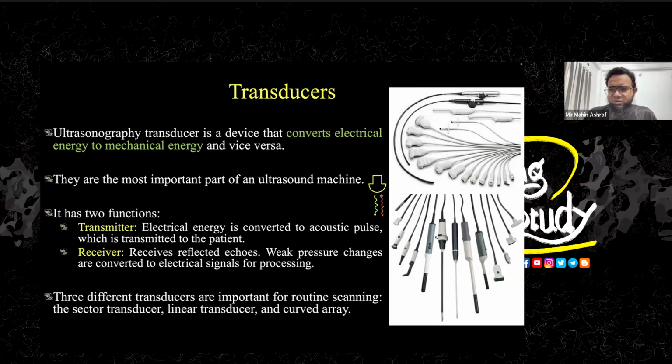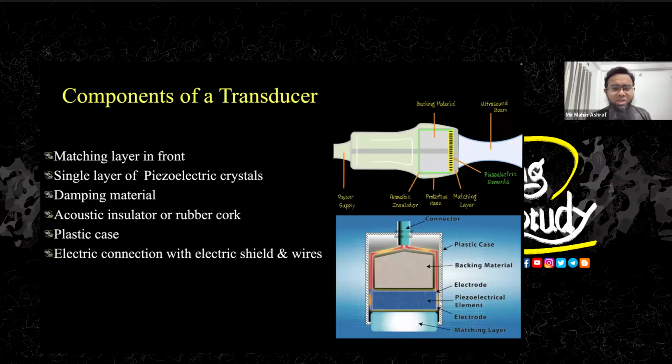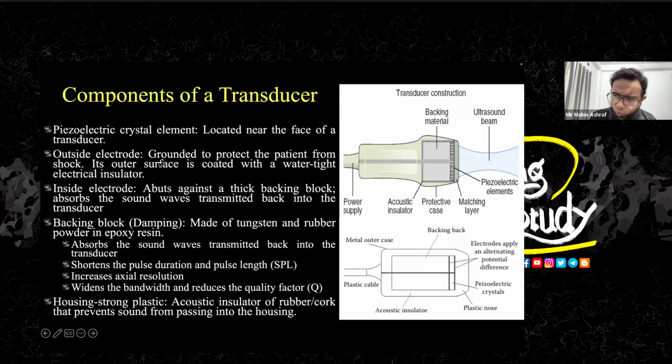If you don't have a transducer, what will you do? You have nothing to do. You need a transducer to do the ultrasound. So the transducer has different components. I won't go through every part. Every part has its own mechanism. I think you are not here to know the use of the housing, strong plastic.